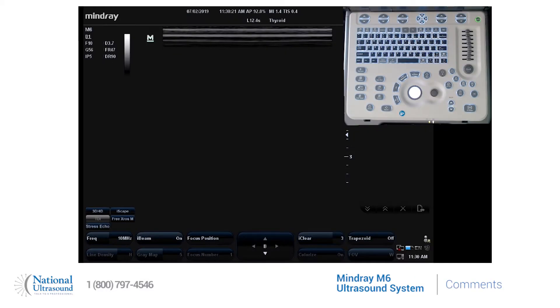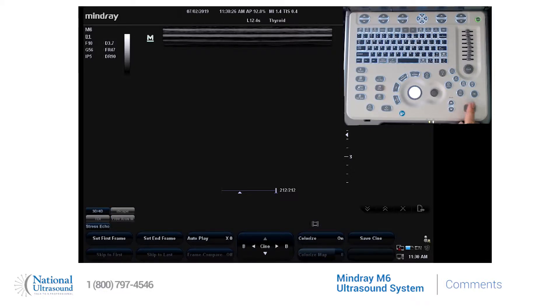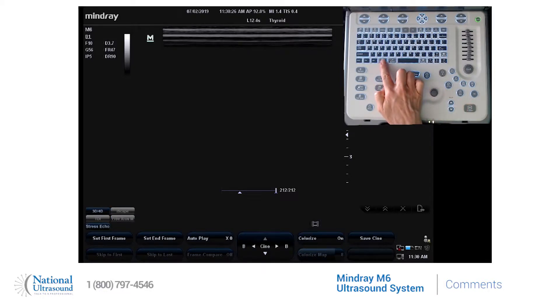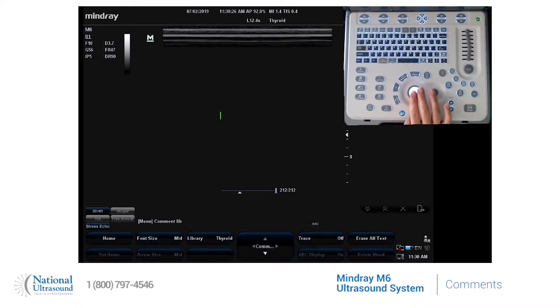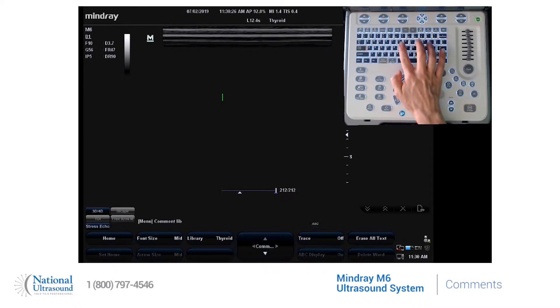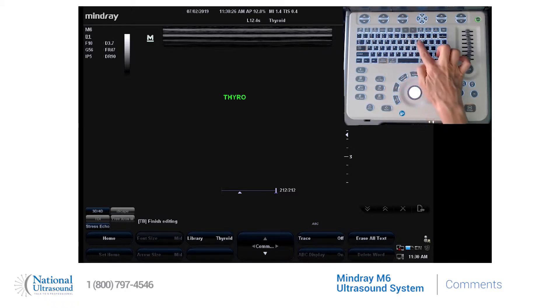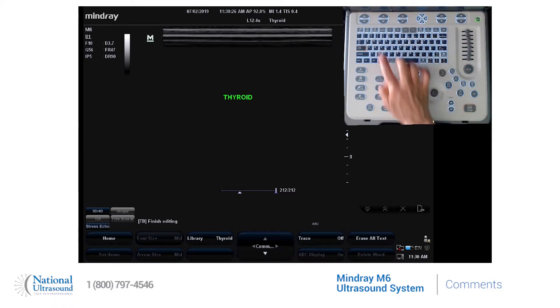If you would like to add text or labels to your images on the M6, press the freeze button. There's an ABC comment button to the left of your spacebar. A cursor will appear. You can manually type with the keyboard if you like.